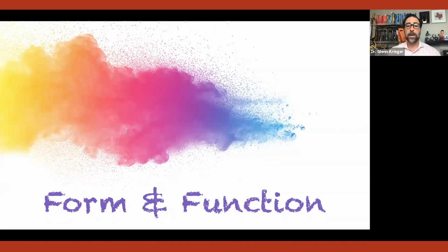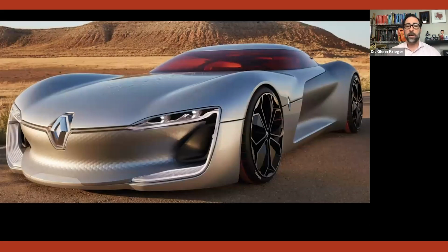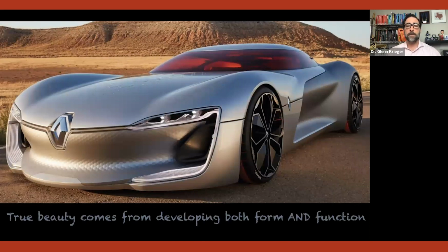The second place that's helped me tremendously is form and function. In order to satisfy a good outcome, you need to have both form and function. As I demonstrated from that first case, I could put a wire in and straighten those teeth out. But if those lower teeth are still tipped lingually, I haven't treated the function. I've treated the form. And so it's very, very important for me to put those teeth where they belong, create proper form and function, and that applies from the chin up to the nasal airways. So again, CBCT has helped me there tremendously.